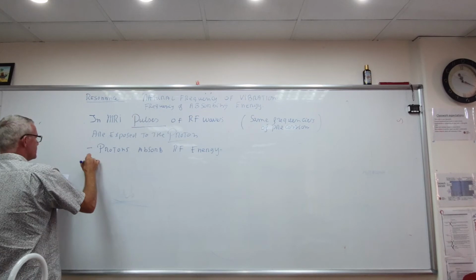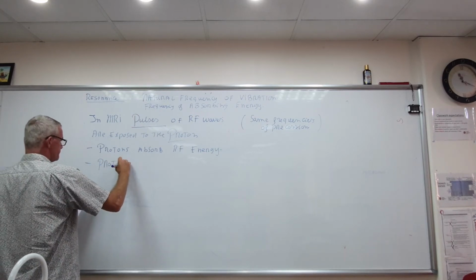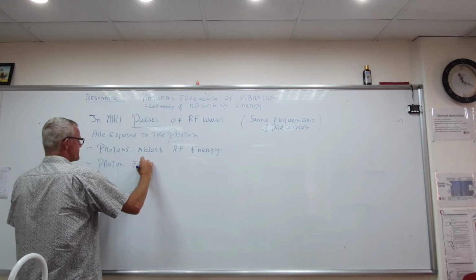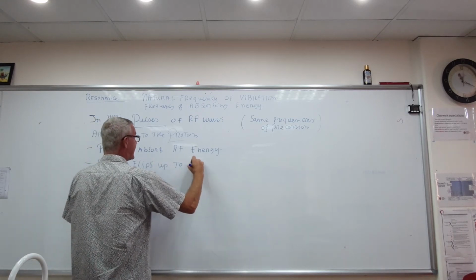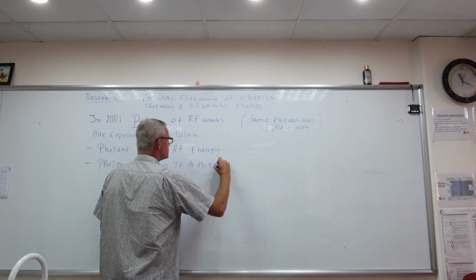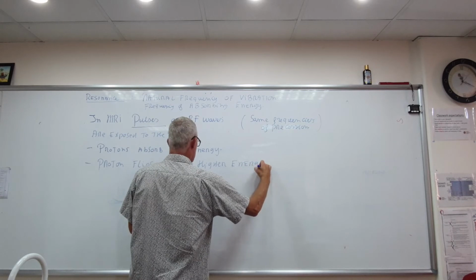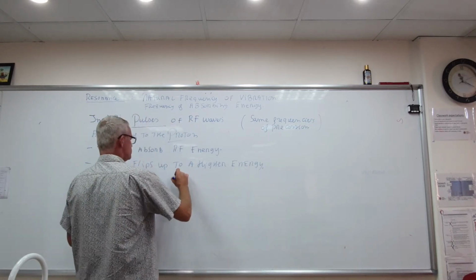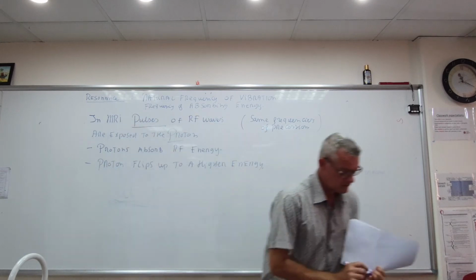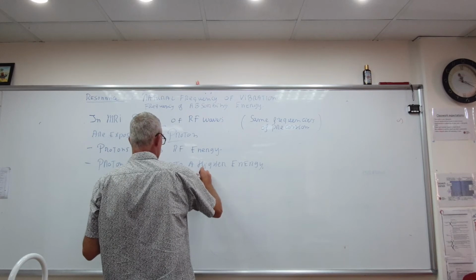Yeah? And what will happen with the proton? Proton flips up to a higher energy. Okay? And this is what we call the nuclear magnetic resonance.